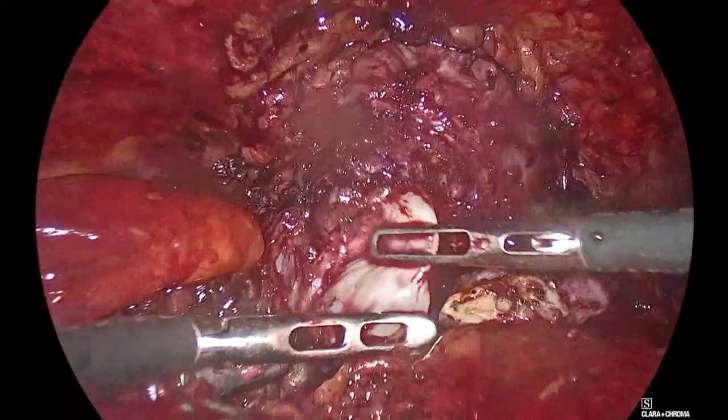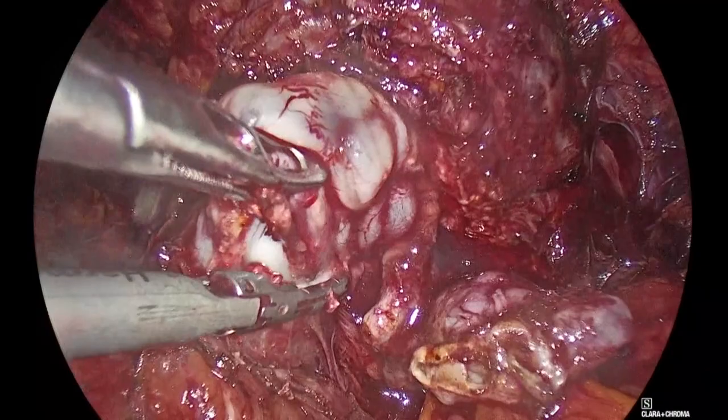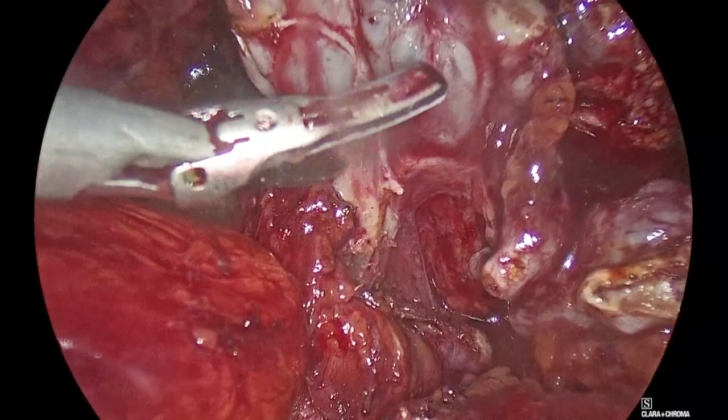Leave it to me. Open the field for me with your two graspers. Yes, there. Excellent. You see how he can serve the field nicely to me and I can really do a nice job. And you see, this is done. Good. I think the assistant is a key part of this. It's a mistake to believe it's a single surgeon operation. Key point, completely key point.